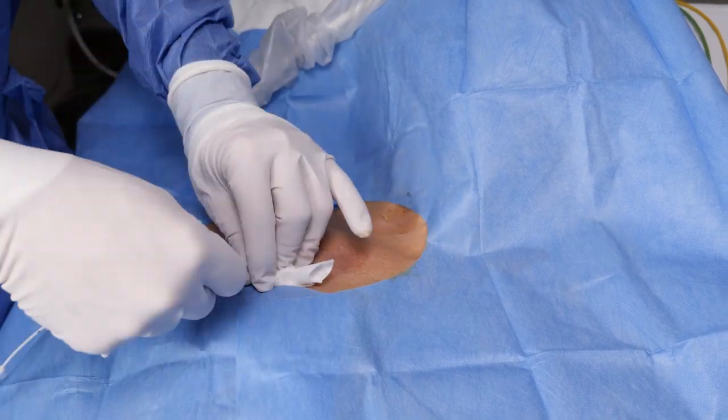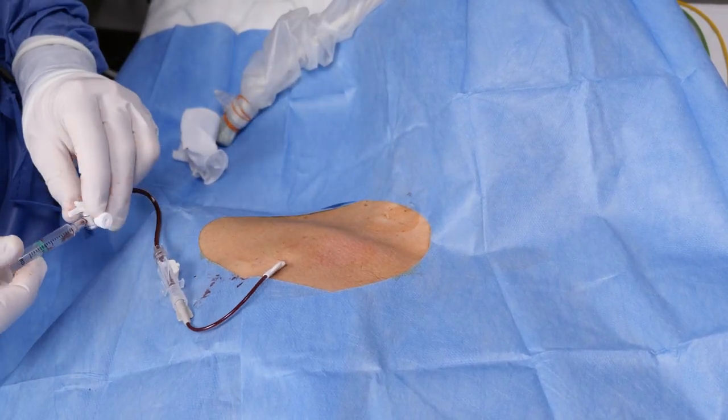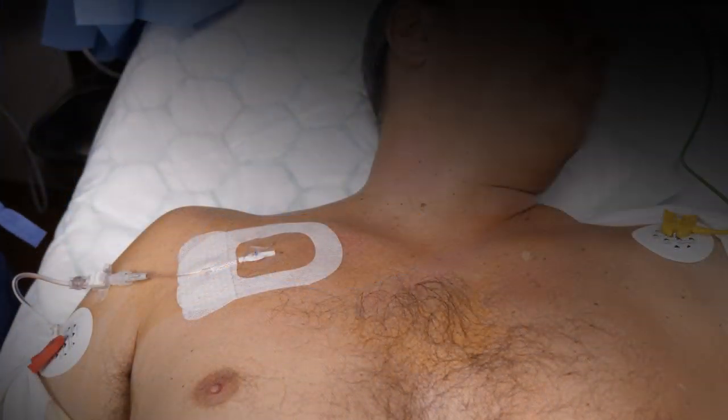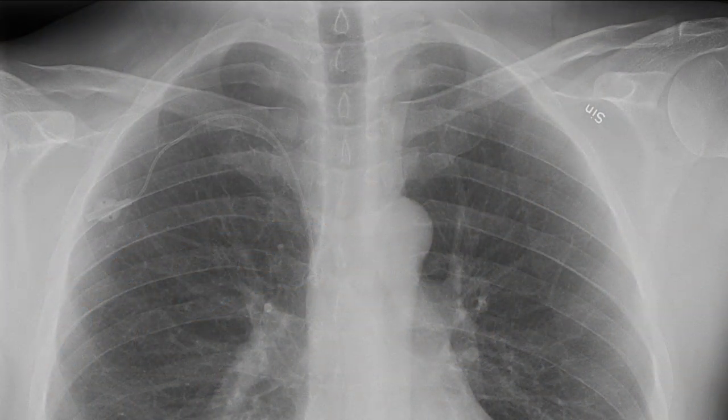Proceed with the central line in the usual manner, and further confirm the venous placement by observing the height of a non-pulsatile blood column. We're currently performing a validation study, but we believe many post-procedure x-rays will be redundant if the guide wire position has been confirmed using this technique.